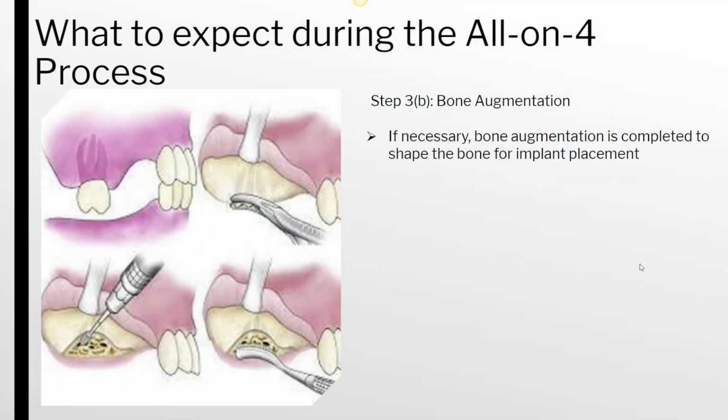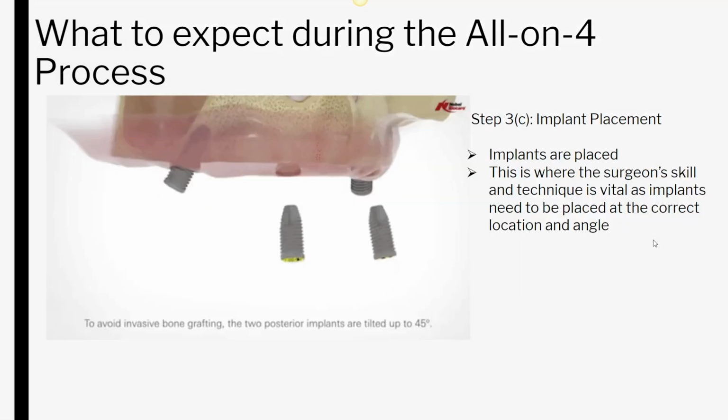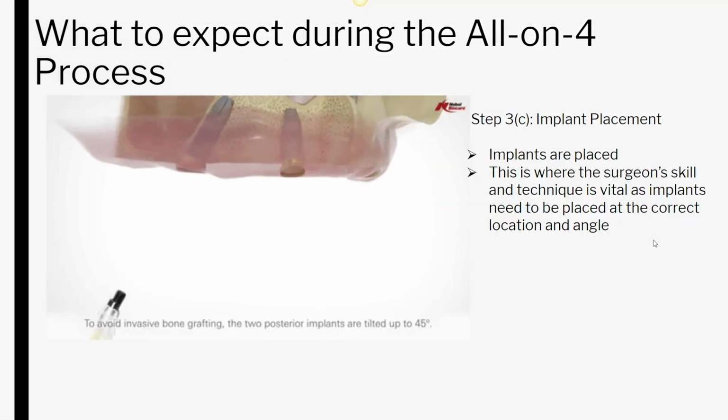As we mentioned earlier, there is some bone augmentation. What that involves is we may have to add some more bone in some areas, and in some areas we're just really going to be smoothing out that bone. The next step is we're going to place your implants.